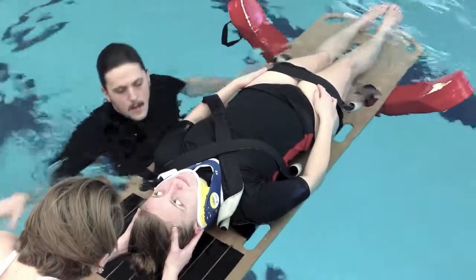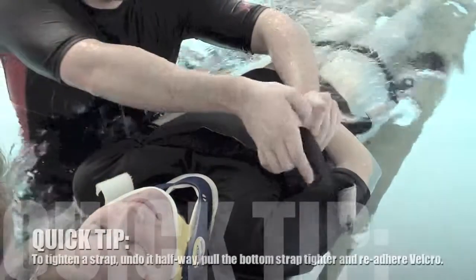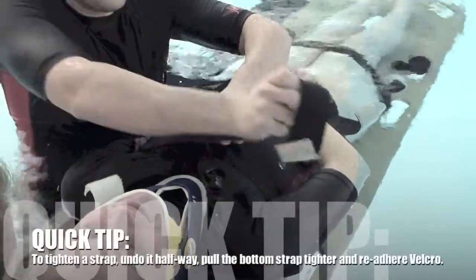If a strap is too loose, undo it halfway. Pull the bottom strap until it is tight and then re-adhere the straps together. It is okay if there's a kink in the straps.